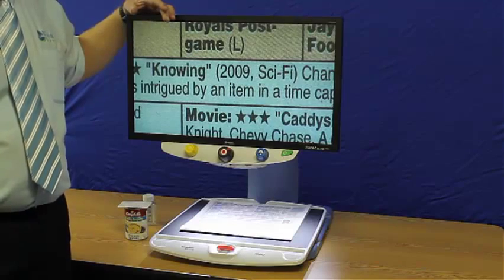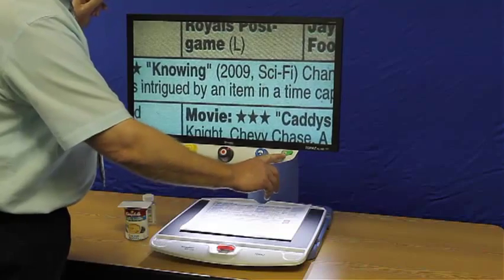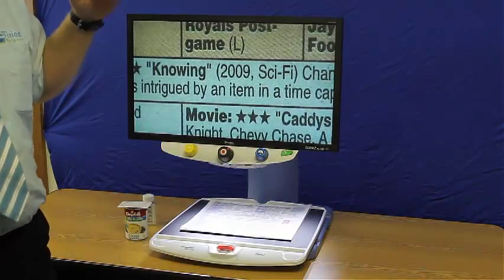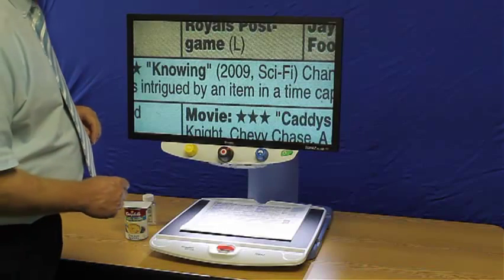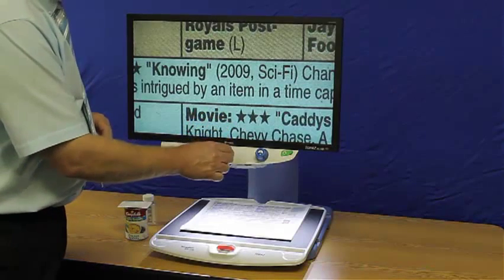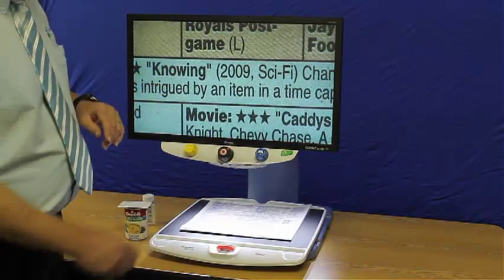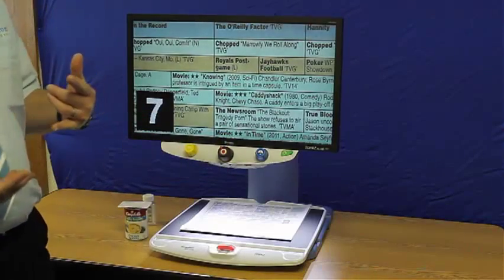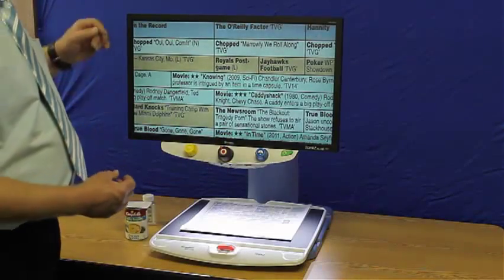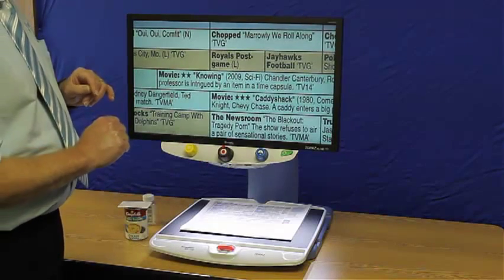Basic functions are very simple and easy to use. First of all, on the right, the green switch is the power button where you turn it on and off. One button does it all. In the middle is the most important button. It's the one you'll probably use the most because it controls the size. By turning it to the left or the right, you change the size of what you're looking at. Turning it right makes it larger, left makes it smaller.